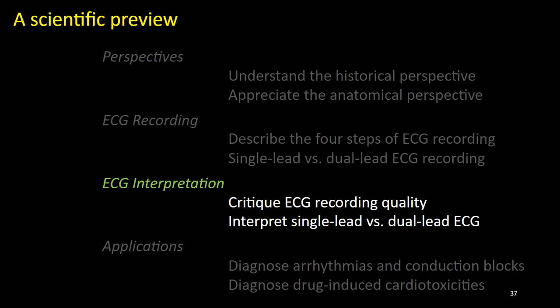There are at least 3 factors we can control to reduce noise, going from large to small physical scales. First, when setting up the ECG station, avoid setting it up close to any powerful generator sources of electrical noise and hum, such as large fridges and freezers. Second, in setting up recording, use noise filtering.